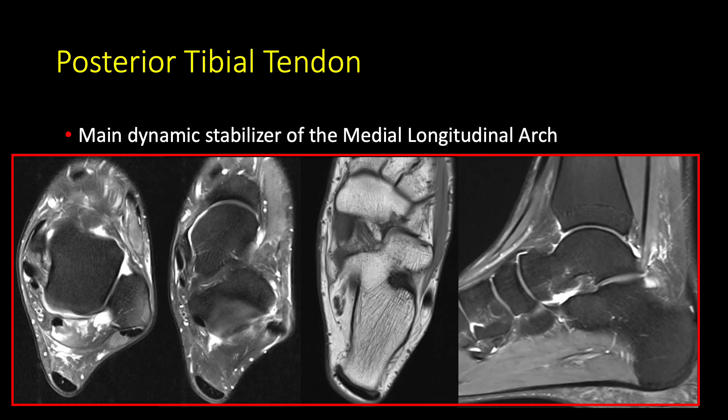The posterior tibial tendon is the main dynamic stabilizer of the medial longitudinal arch. I'm going to highlight that in red all the way to the main insertion onto the medial pole navicular. In the sagittal image, in this normal foot, we see a line drawn through the long axis of the talus intersects, if continued, the long axis of the first metatarsal. This is someone who has a preserved medial longitudinal arch. I've highlighted in blue the supramedial component and the medial plantar oblique component of the spring ligament. Notice that the supramedial spring ligament is located between the deep surface of the posterior tibial tendon and the medial talar head.